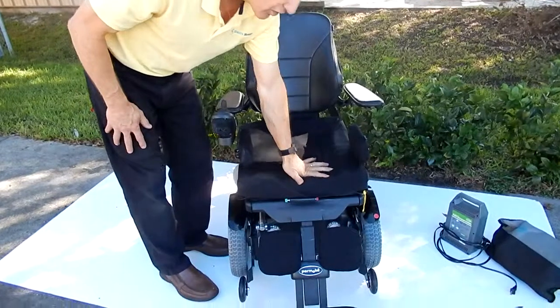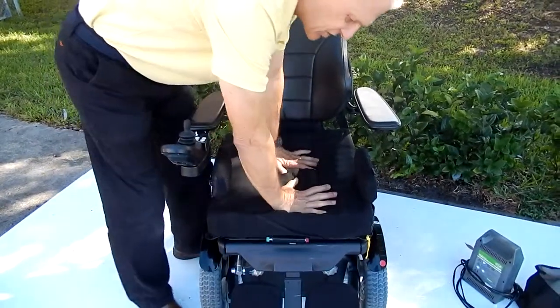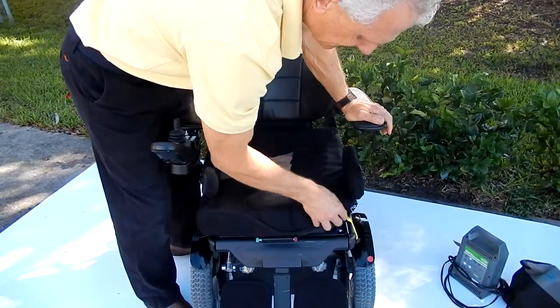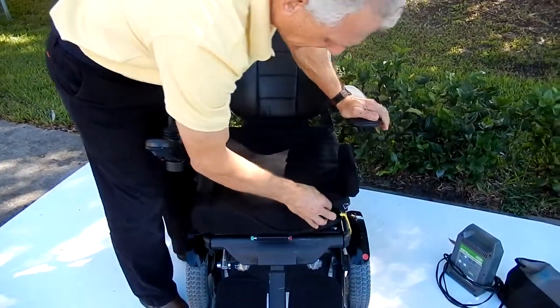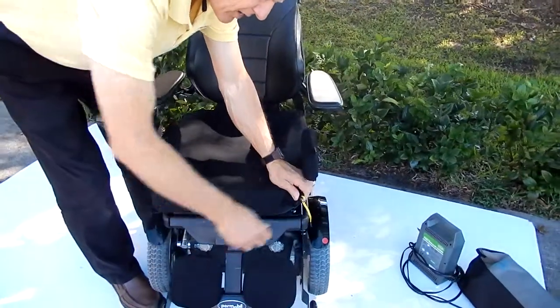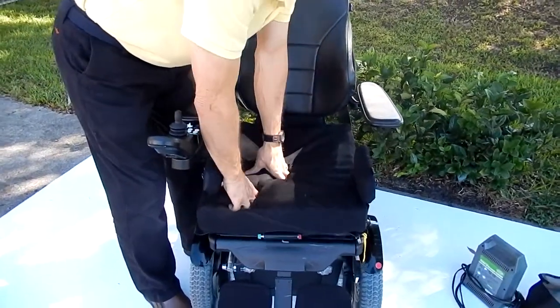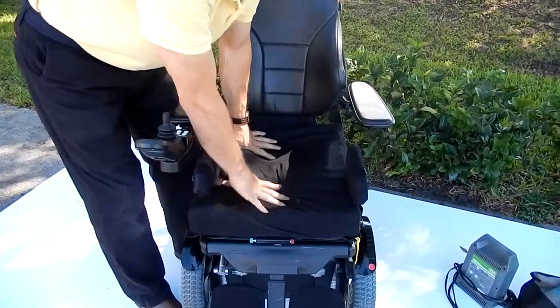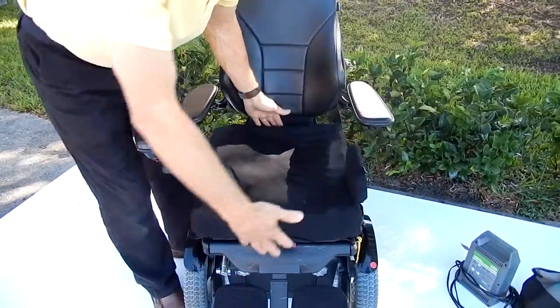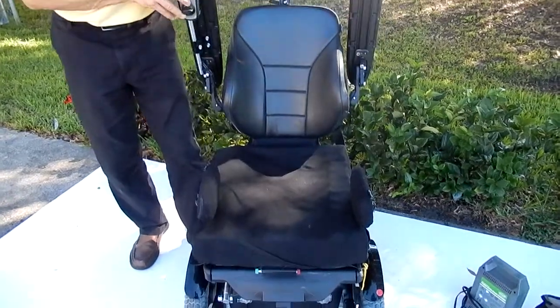This chair has a Roho cushion — this is a $400 air cushion. It can be adjusted with a pump. Right over here there's a valve inside that you pull out, and we have a little pump that comes with it. You can pump air in depending how hard and firm you want it. This is one of the best seats available. This seat is 18 inches wide by 18 inches deep.